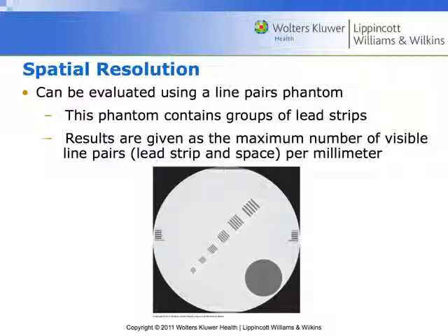So we may even place an ROI on that. Can I visually read that? Can I differentiate? Can I see that that's 4 or 5 lines, right? These are the questions we're asking ourselves and making our notes in our documentation. Versus up here, can I clearly differentiate those lines? Does it have an appropriate spatial resolution?